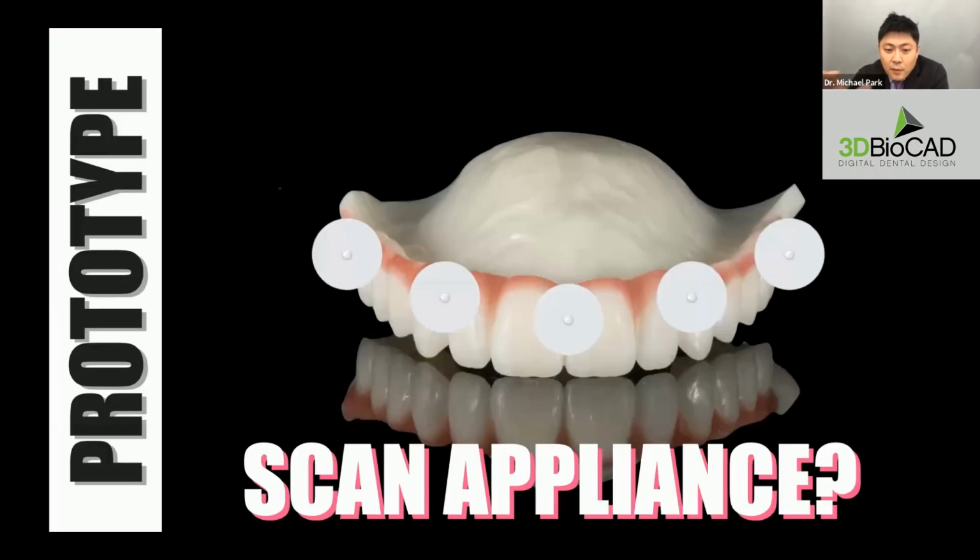And although the prototype is good for checking the aesthetics and phonetics, it's not a very good scan appliance because it doesn't have a buccal flange. And we need that buccal flange because we need to ultimately place anchor pins to stabilize the surgical guide. And if we use this as a scan appliance, we're not going to have that buccal flange on the surgical guide as well.